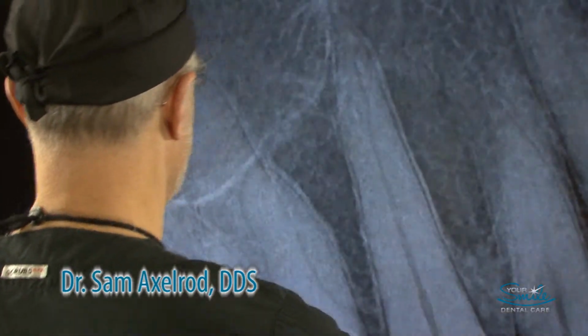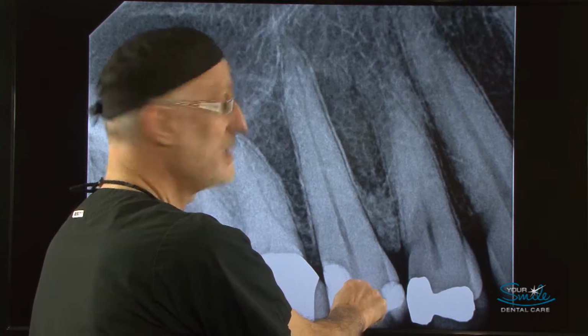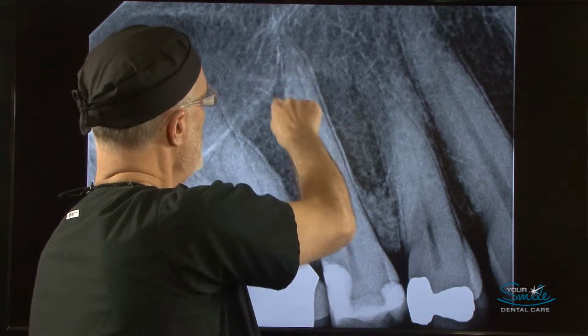So you need a root canal. It's really not as scary as you might think. Let's take a look. Here is your tooth. Notice a large filling in it, new decay around the filling, the nerve chamber, infection in the surrounding bone.